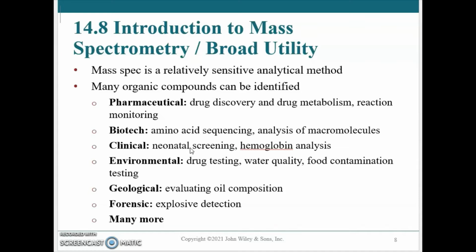Certain drugs may be monitored by their metabolites. Drugs with highly variable metabolism and bioavailability may require individual patient monitoring. An example would be the organ transplant rejection drug rapamycin, also known as sirolimus.